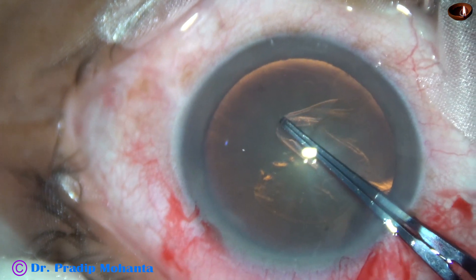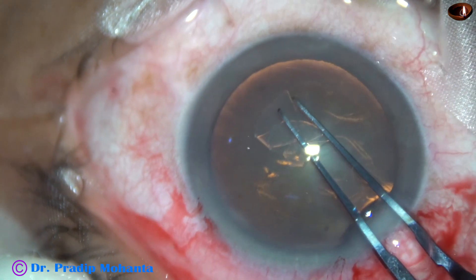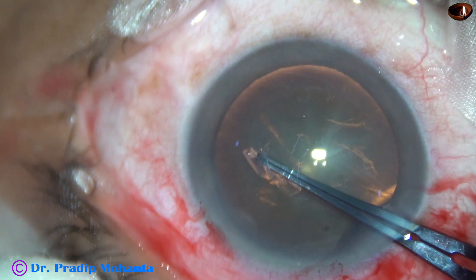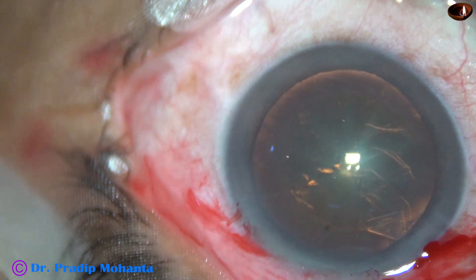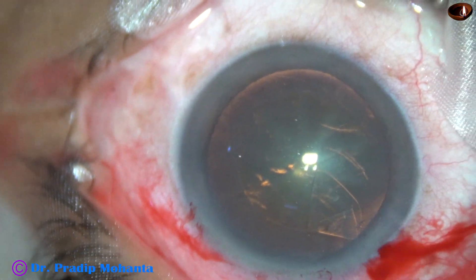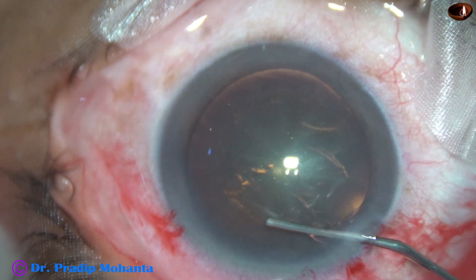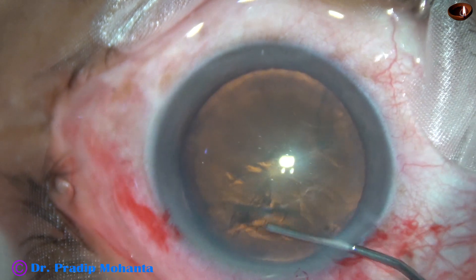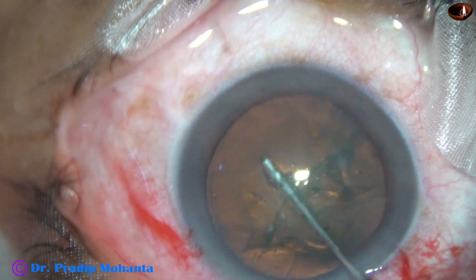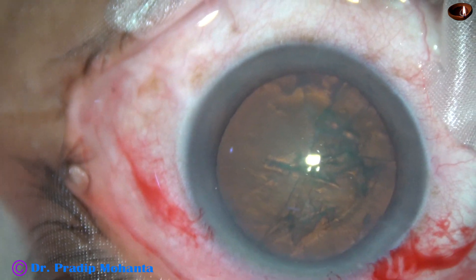Capsulorhexis is being done with the help of utrata forceps. This rhexis is a bit eccentric — it is not central — but it doesn't matter. The lens will be nicely centered. Now hydrodissection is done, and a bit of hydrodelineation is attempted. The nucleus is mobile now.